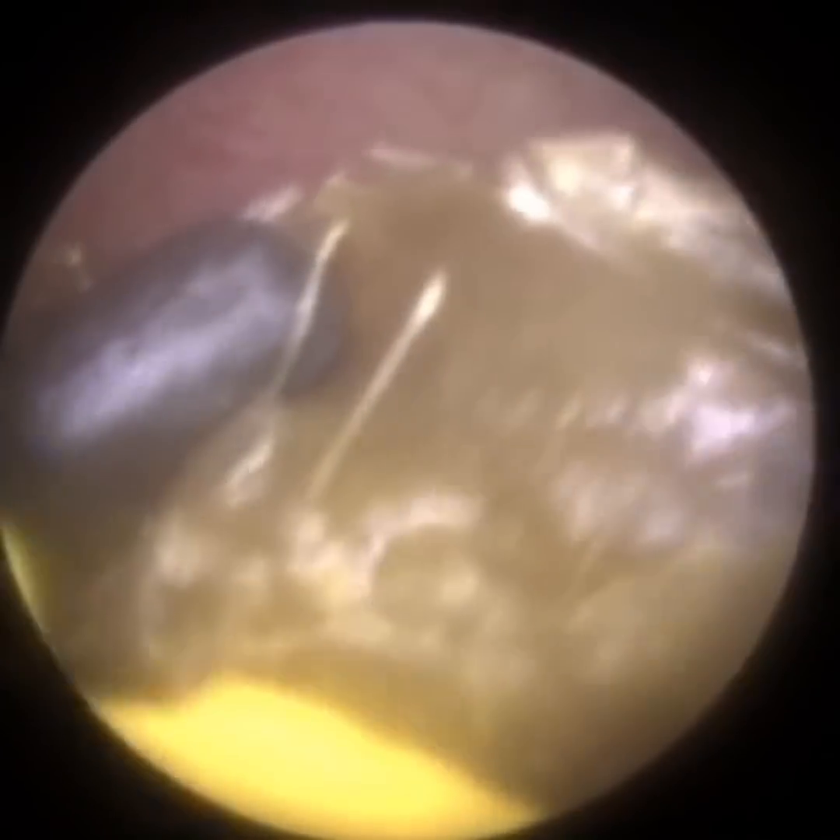Another question was about the cost of these instruments because they're single-use. In terms of what we charge for the procedure, it's a very, very small cost — they're very cost-effective, these single-use instruments.